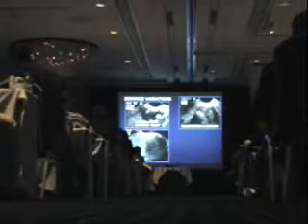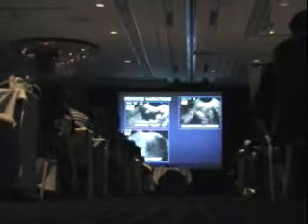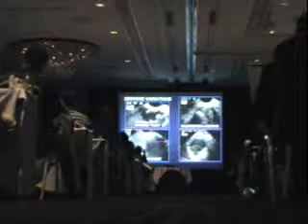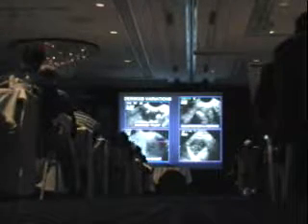What about this? These are the kind that you have trouble with because they kind of look like bowel. You know, they're hard to see, and you often can underestimate their size. And it's really that big, and that's probably the hair. I'm not sure what all that stuff is. It's a lot of echo. You can have very complex fluid with dermoids. And what about this? Well, I call that a bad hair day. That's when your hair is flying all over the place.